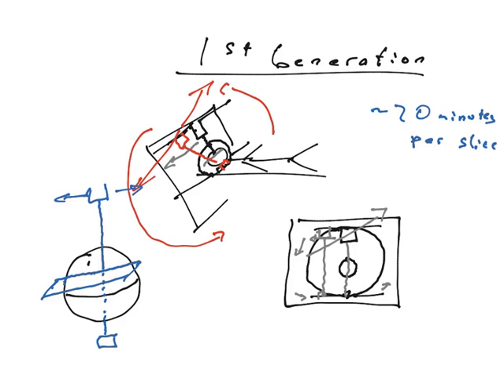And so then you'd have to slide the object in just a little bit further into the machine, and it'll take the next slice. Goes all the way around the body, 180 degrees, creates an image of the next slice. Then you slide the body into the machine a little bit more, and you go the full 180 degrees all over again.